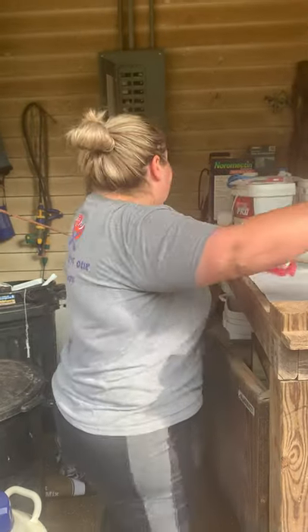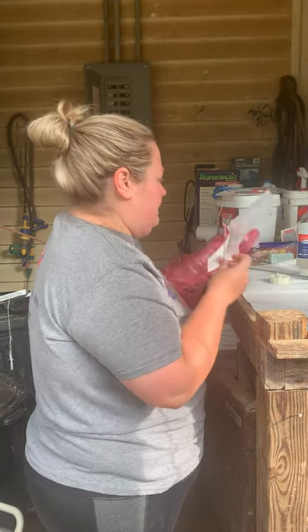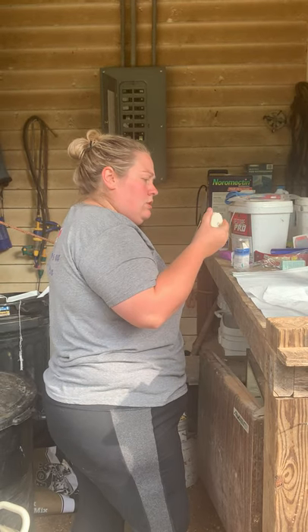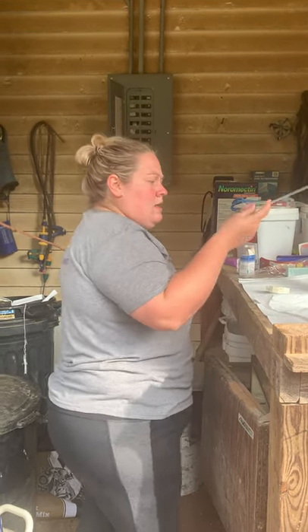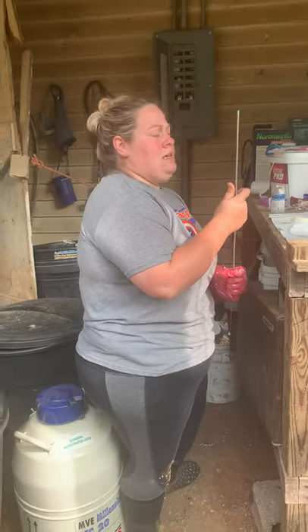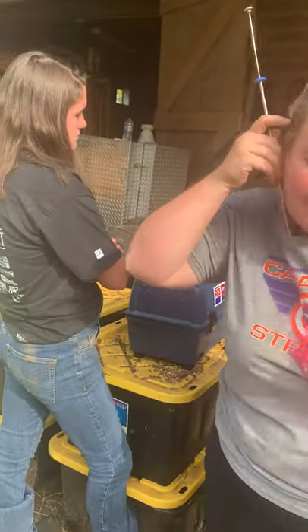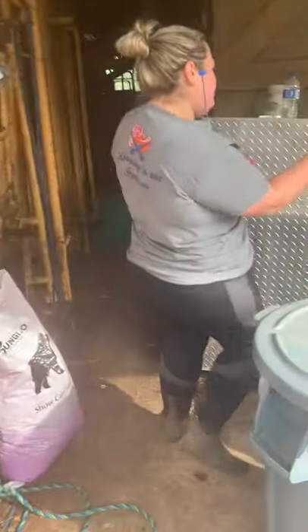I need to dry this off really fast. What I do is I put the cotton in first — and like I said, this is timed so you want to go as quickly as you can. I cut off the end of the tip and then put my sheath on, then roll the sheath up. I'm going to let the rod barely tip so the end is in my shirt to stay warm. Now I'm going to come over here and lube up my arm.